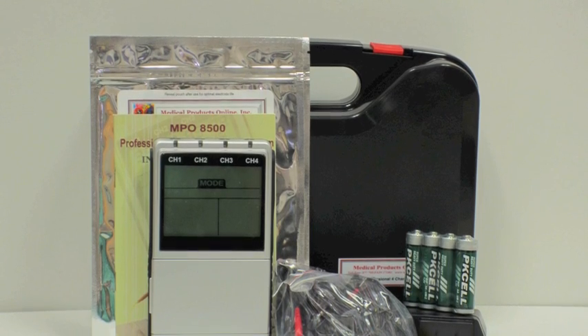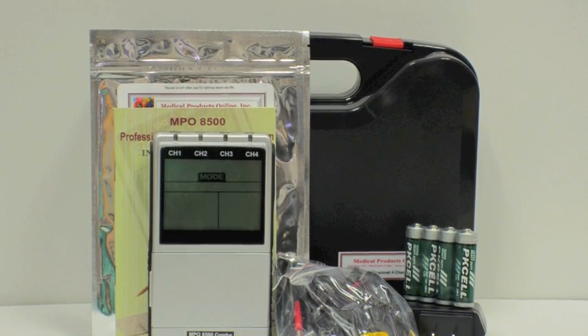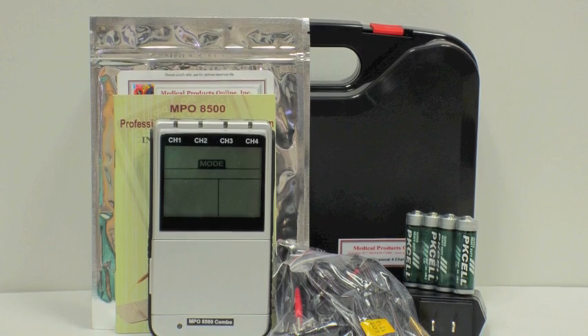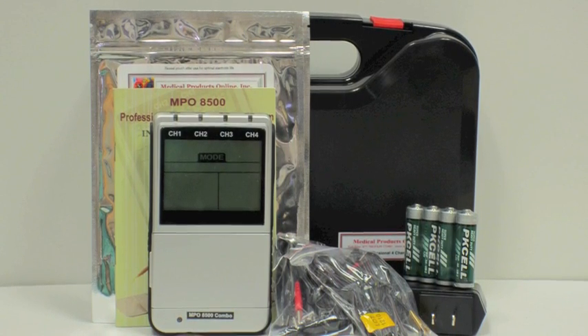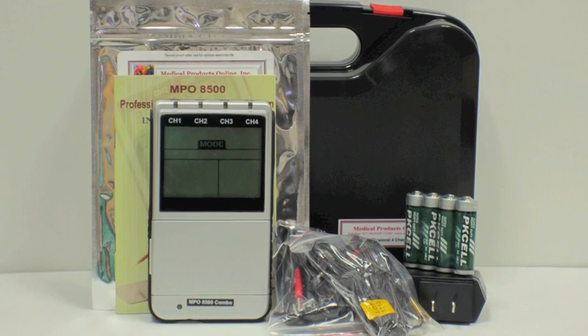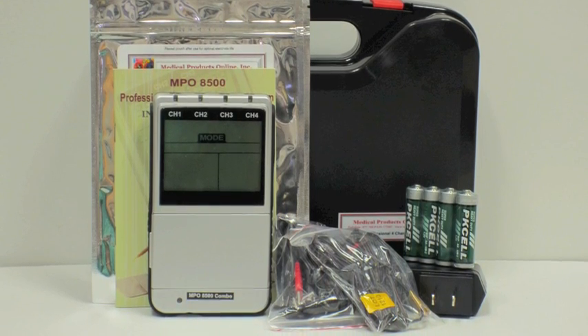Your unit comes with everything that you need to get started: an instruction manual, two sets of electrodes. Remember, this is a four channel device so up to eight electrodes can be used at the same time. Also included are batteries, lead wires, two sets, the AC adapter, and the unit itself.